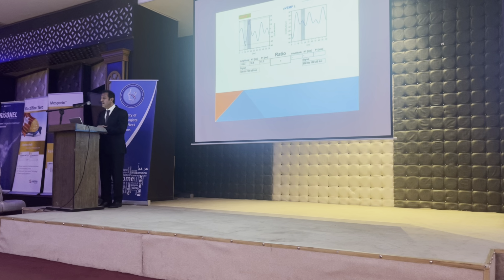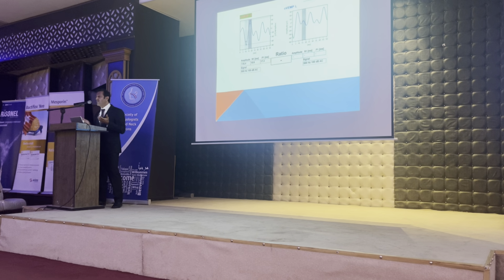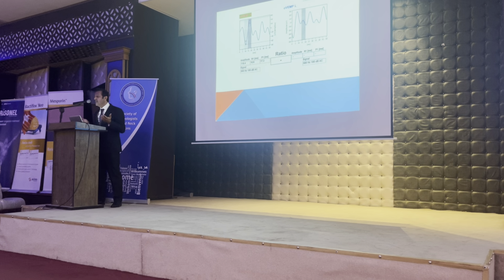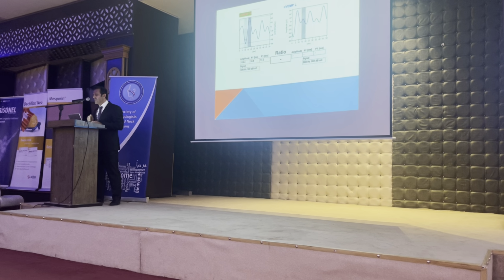This is oVEMPs. You can see there is a wave on the right side and there is no wave on the left side. This is also significant, showing there is a superior vestibular nerve problem on the left side.